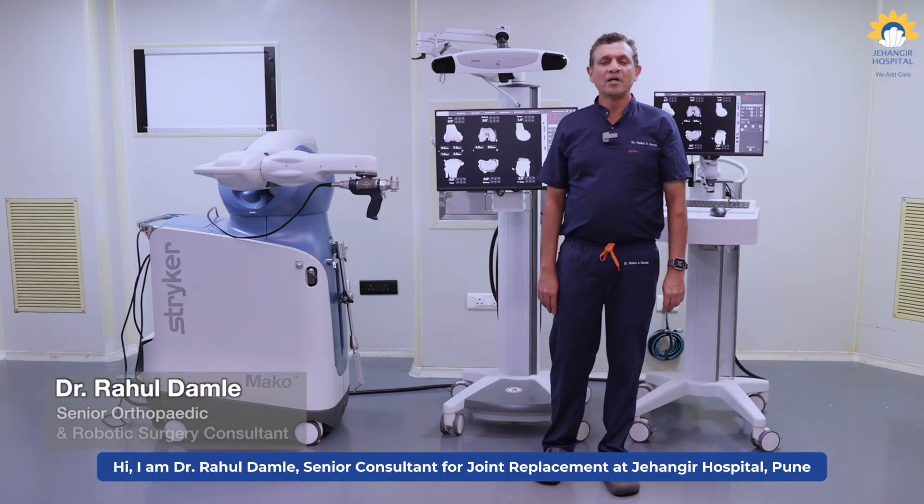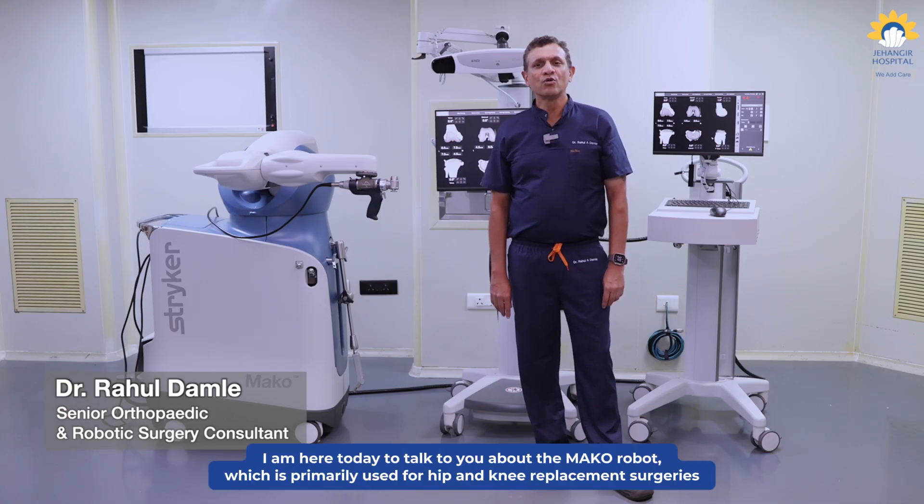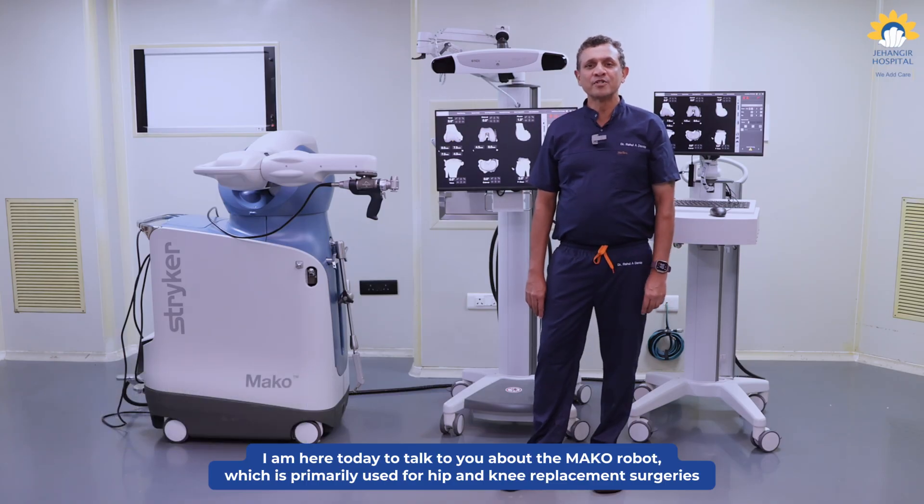Hi, I am Dr. Rahul Damle, Senior Consultant Joint Replacement at Jehangir Hospital, Pune. I am here today to talk to you about the Mako robot, which is primarily used for hip and knee replacement surgeries.